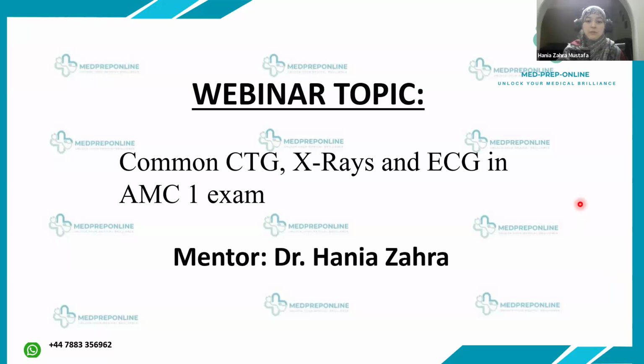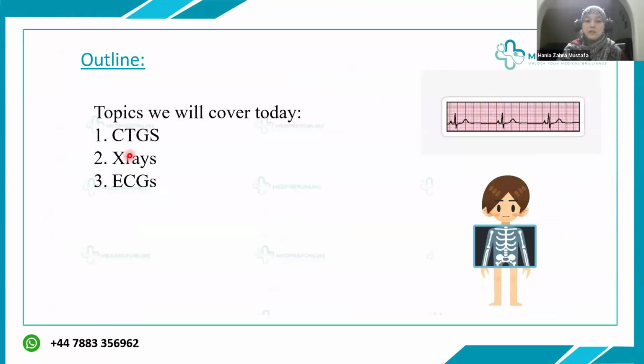And today, our webinar topic would be CTGs, X-rays, and ECGs that are commonly tested in the AMC MCQ exam. We will first start with the CTGs, and I will tell you how you interpret them, and how you solve the questions of CTGs. We won't solve the questions exactly, but I will tell you how questions will be asked from which aspects. And then we will do the common X-rays and ECGs.